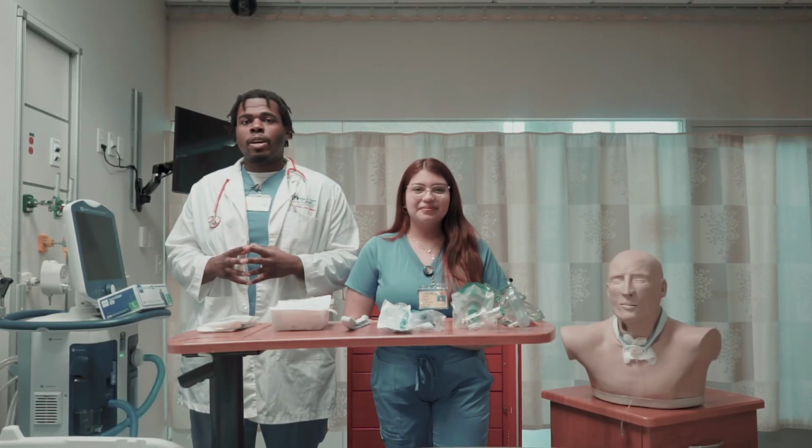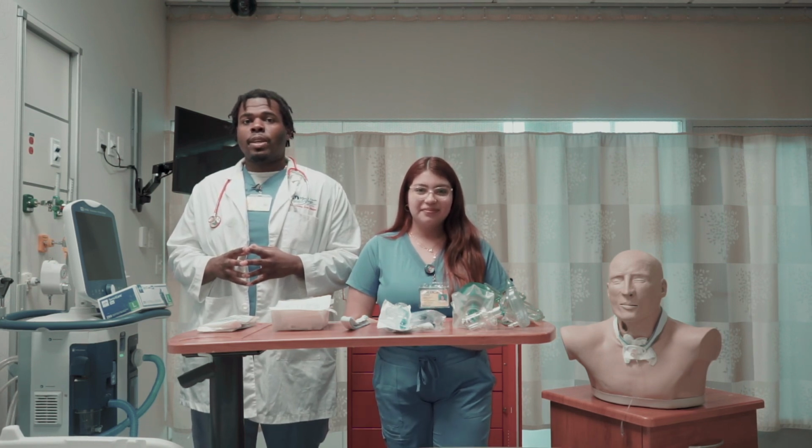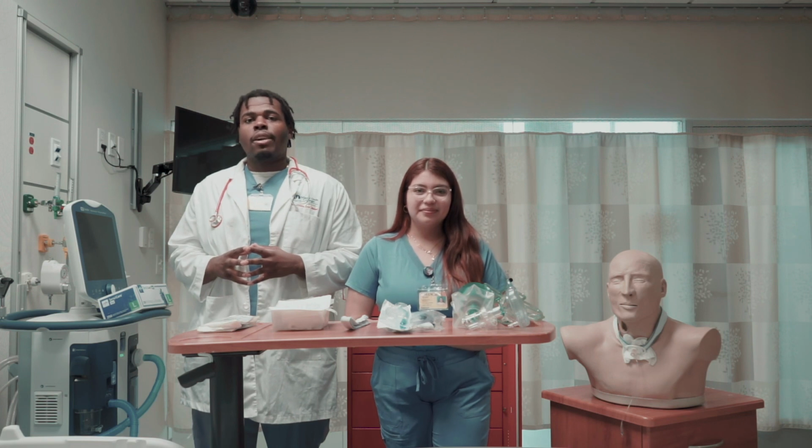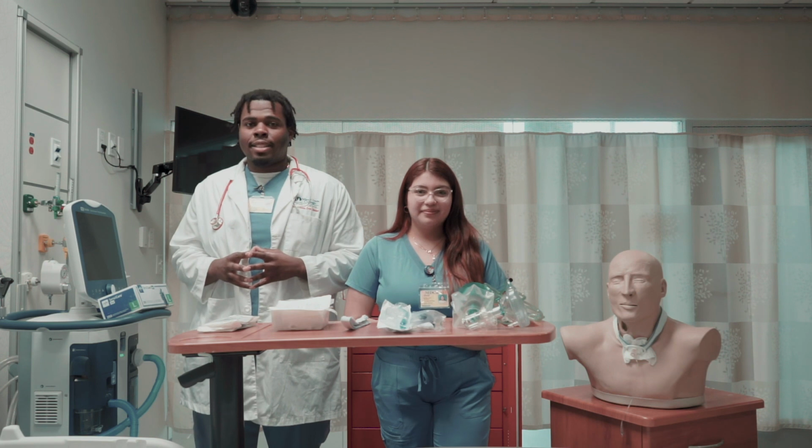Today we're here to demonstrate how to perform tracheostomy and stoma care. The indication for tracheostomy and stoma care is if there's a trach in place. A contraindication is if the patient is unstable, and a hazard is decannulation.